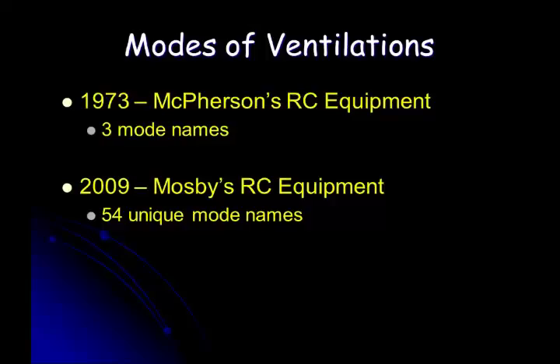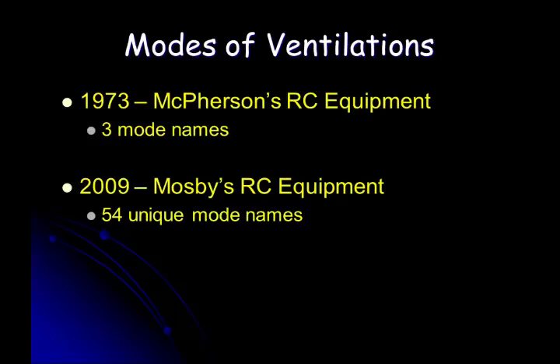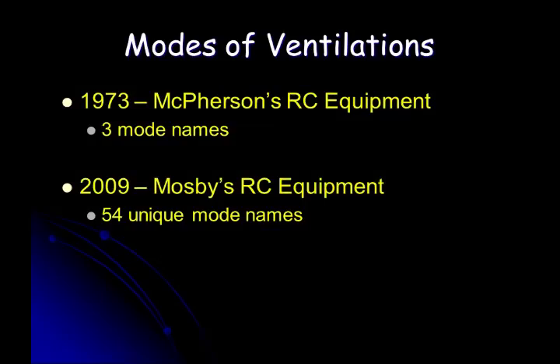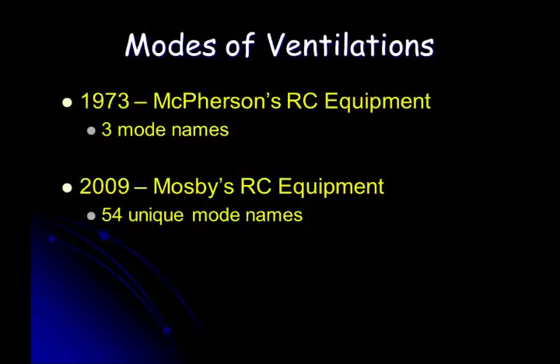The mode, when I talk about mode of ventilation, I'm talking about how the ventilator and the patient interact. So when the patient wants a breath, what happens? How does the patient and the ventilator get together to do something?